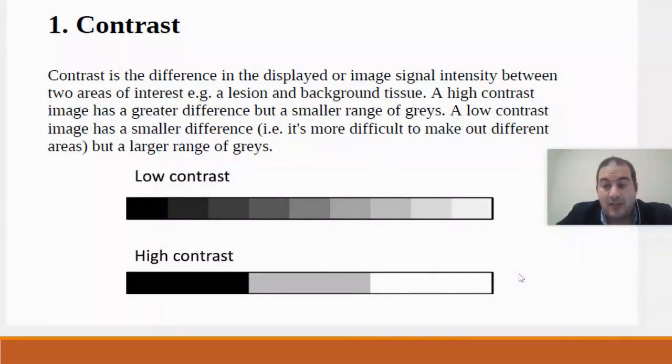Digital radiography is extremely sensitive, meaning you will find that the quantum efficiency of digital radiography and computed radiography is higher than that of screen film radiography. Therefore, it is sensitive and can significantly enhance the quality of the radiographs.